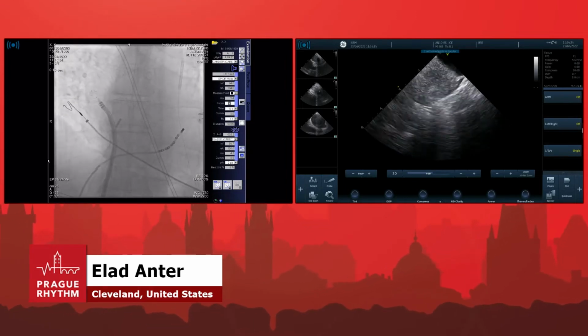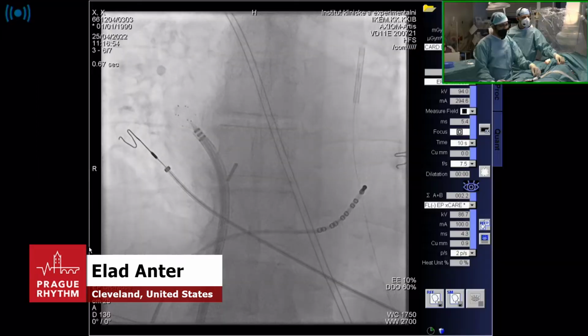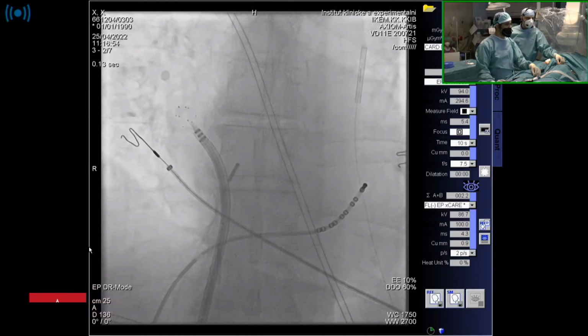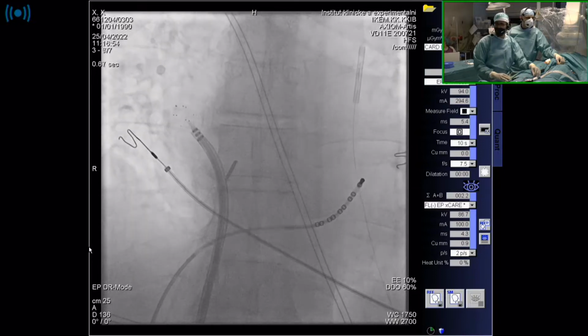So we can tell you what we did so far. So far we went transseptal. We created a quick map of the left atrium, and we'll show you the voltage in a minute. But I want to start by showing you the catheter, how it looks on the fluoroscopy. You can recognize the struts very clearly.